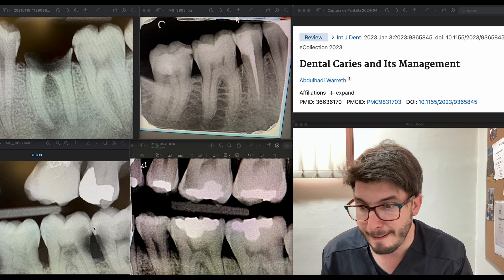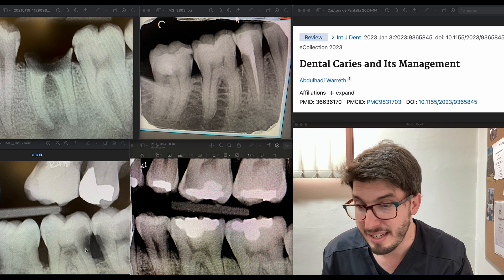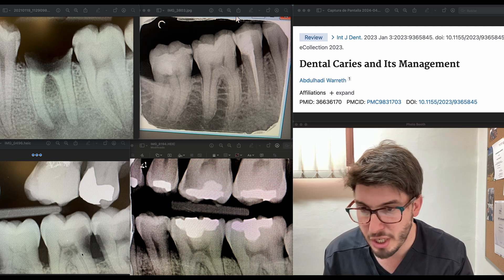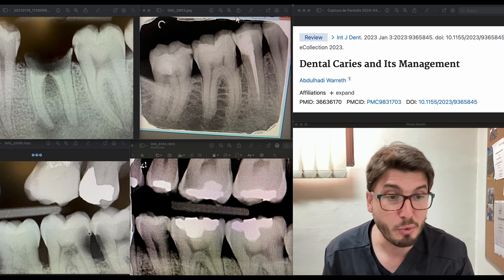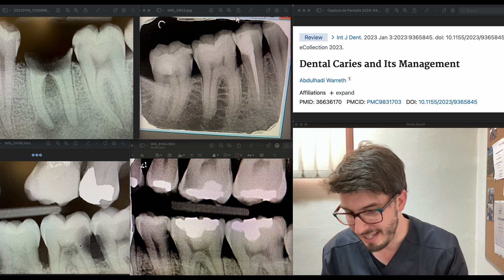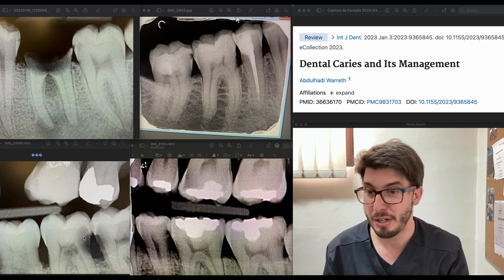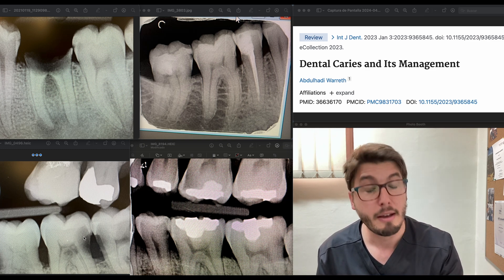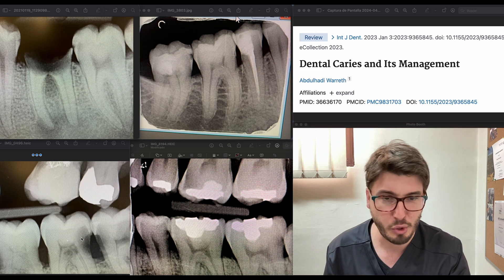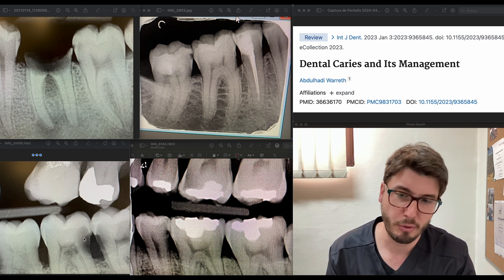In the lower left corner we have a different condition. Look at the distance between the interproximal caries and the root canal — the pulp chamber is atrophic with some calcification inside. The odds are that you will likely expose the root canal when removing caries. This is what happens: you remove the caries, the pulp chamber is atrophic, but you start to see it — if the tooth is vital you'd see blood transparency — and then you would need to open the root canal.